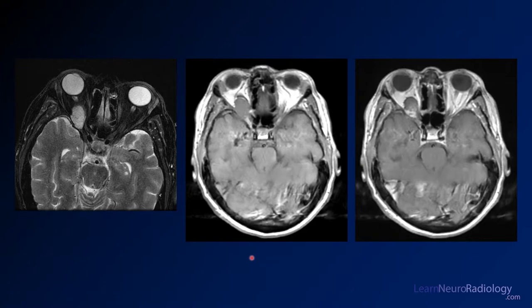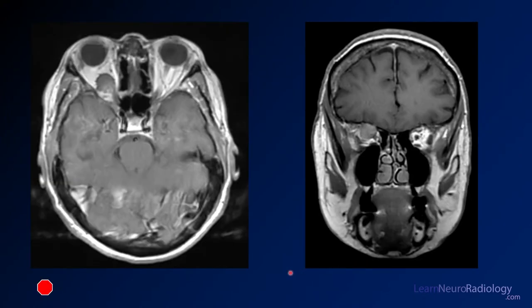Here's an MRI through kind of the same level — this is a T2 through the orbits, this is a T1, and there's a T1 post-contrast here. We also see a couple of post-contrast images: axial and coronal, both through the lesion.